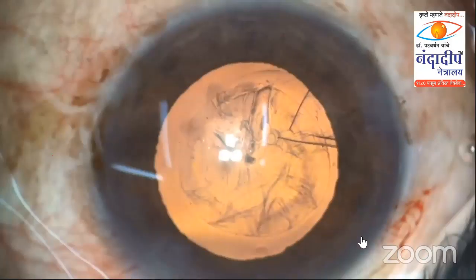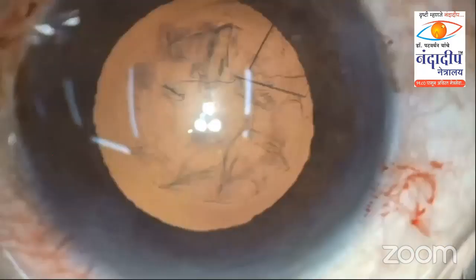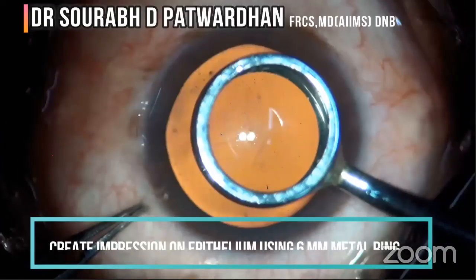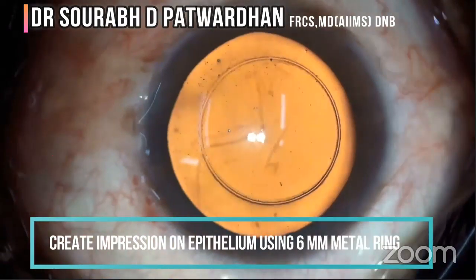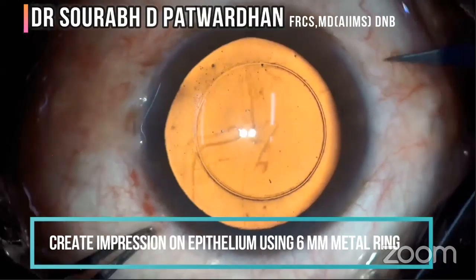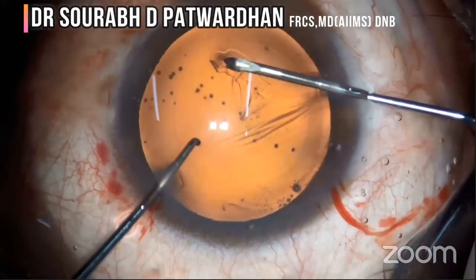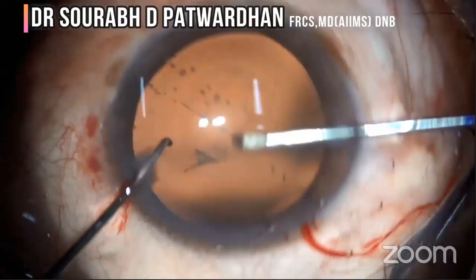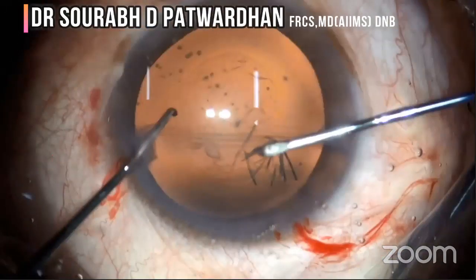Now I want to show the use of a CCC marker also here. The CCC marker is of 6 millimeter size. You can have this kind of ring and press it directly over the epithelium. If you keep the epithelium dry, this mark will stay for a longer time. There is another option, called the Patwardhan-Rexis marker, available with Epsilon, where there are small dented processes. You can stain these processes, and you may get 6 small dots on the corneal surface, and you can follow them to have a rhexis of around 5 to 5.3 millimeter.